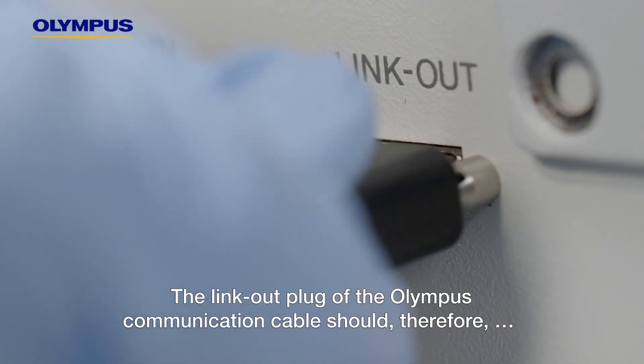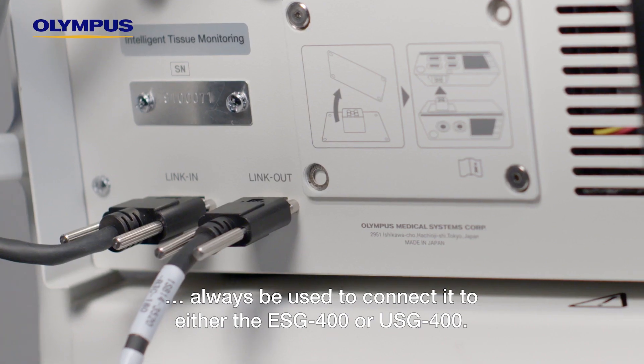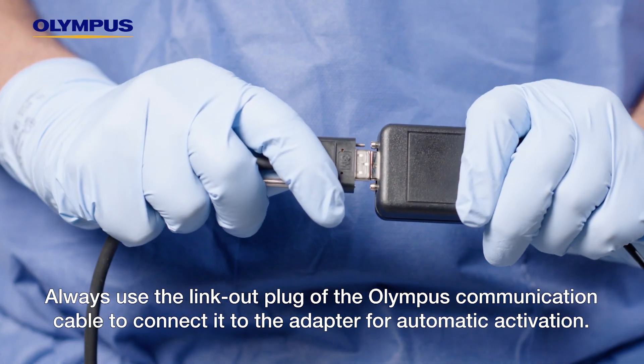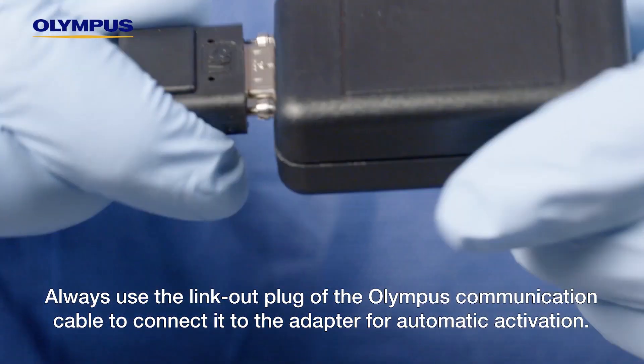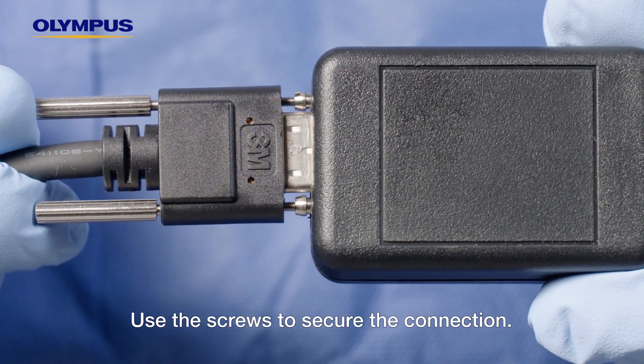The link-out plug of the Olympus communication cable should always be used to connect it to either the ESG400 or USG400. Always use the link-out plug of the Olympus communication cable to connect it to the adapter for automatic activation. Use the screws to secure it to the connection.